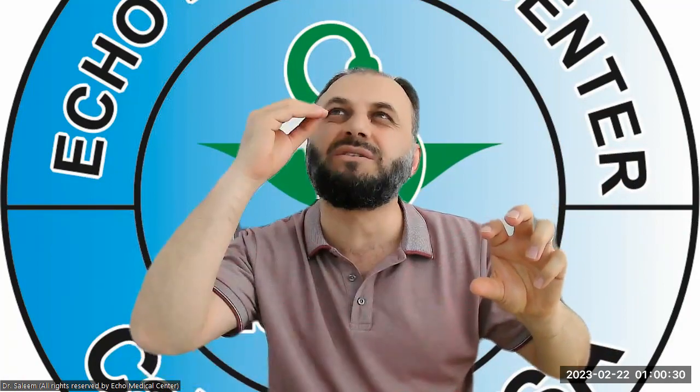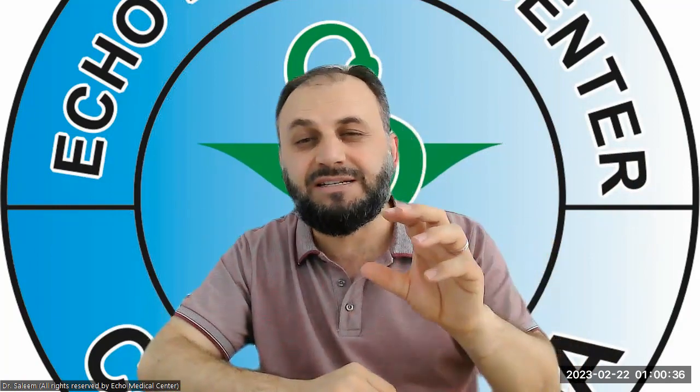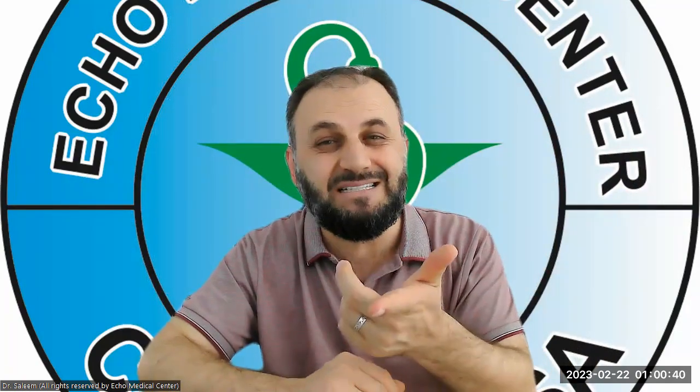So for the ECA, only take the peak systolic, because end diastolic is not accurate. We're not taking that; that's a high resistance. And for the CCA, take peak systolic and end diastolic. Why? Because the CCA itself is a mixture of both, low resistance and high resistance. It's the mixture of the blood flow of the ICA and ECA.